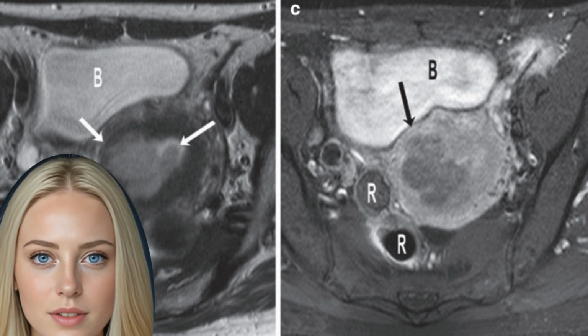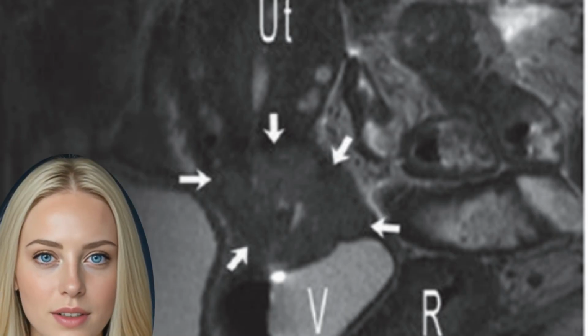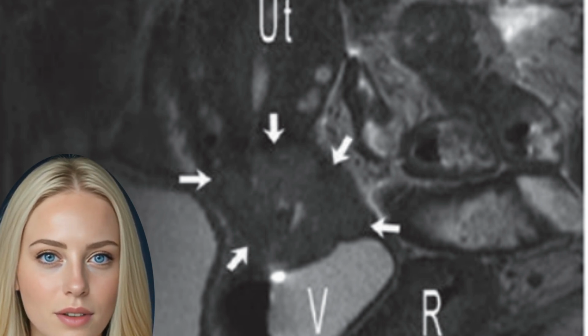This technique can be performed in patients with contraindication for contrast IV, which is of great benefit for further evaluation in case of tumors. For lymph node detection, a native T1WI sequence or proton-weighted (PD) sequence is helpful.